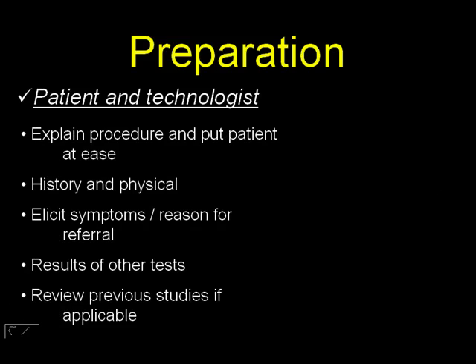It's always a good idea to explain the procedure to the patient. It puts the patient at ease. What we say in our facility is to under-promise and over-deliver. So we always give the patient the general idea about how long the examination will take. Again, it puts the patient at ease and relieves some of the anxiety associated with any diagnostic testing.